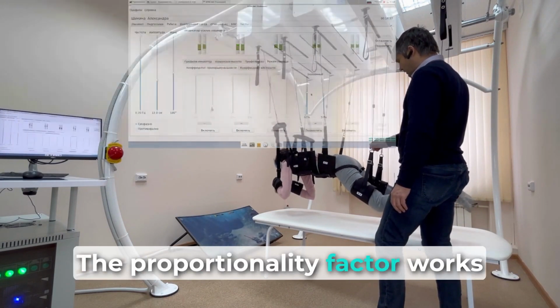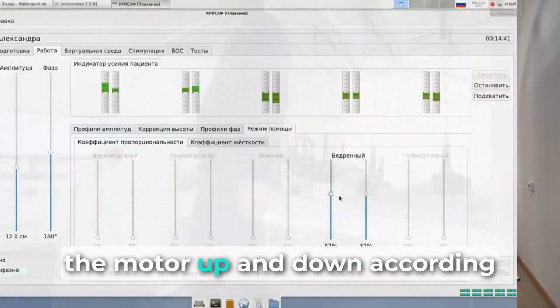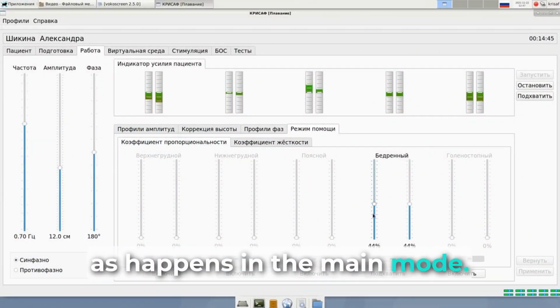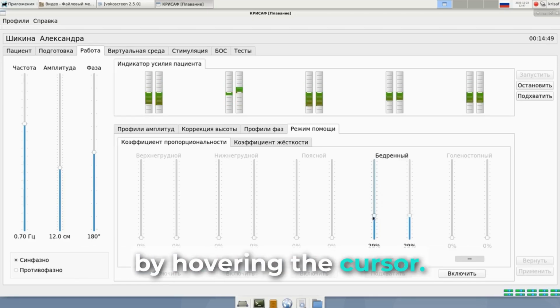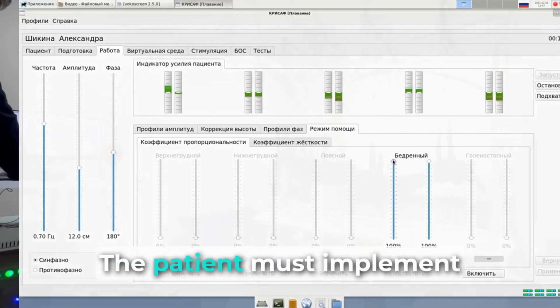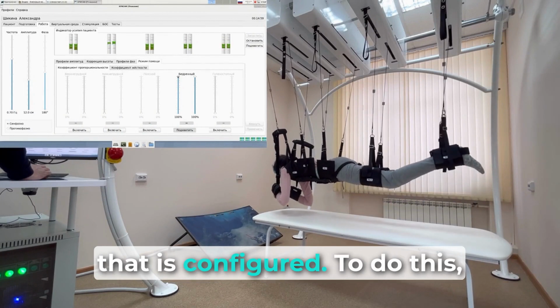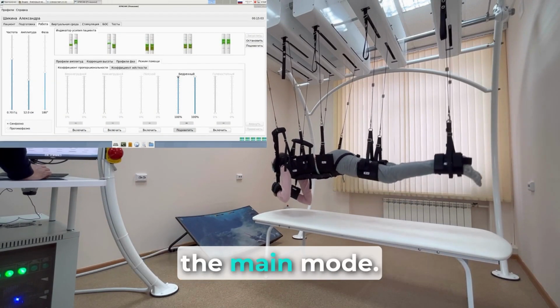The proportionality factor works in such a way that a small amount of force is generated by the motor up and down according to the movement cycle, as happens in the main mode. You can adjust it with the wheel by hovering the cursor, or by grabbing the slider above with the left key. The patient must implement exactly the movement pattern that is configured. To do this, you need to make it clear how the movement occurs using the main mode.